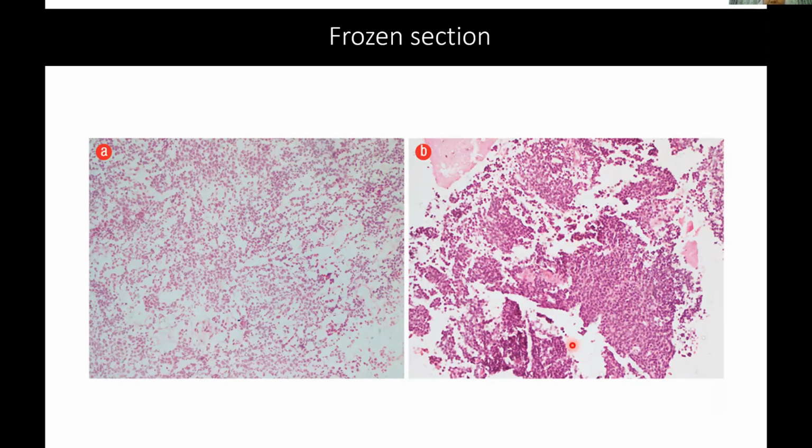Sometimes the spaces are a lot. It can cause trouble or difficulty for us in analyzing this slide. Sometimes we wonder whether it is part of the tumor cells or whether it is artifact. So sometimes it's quite difficult.